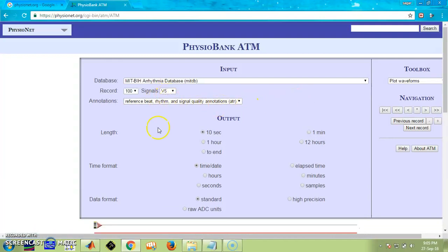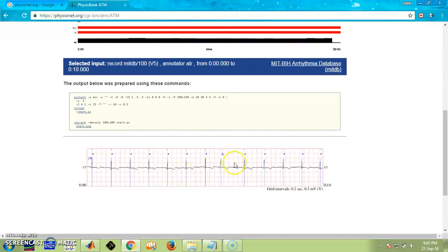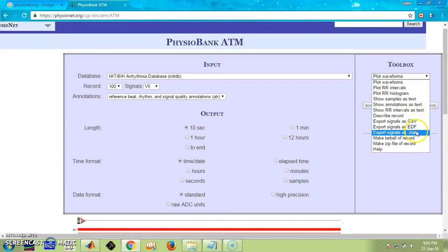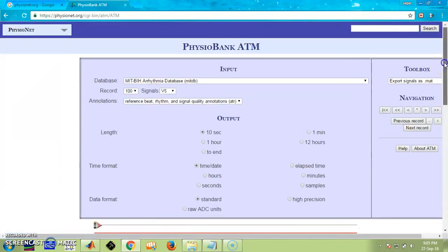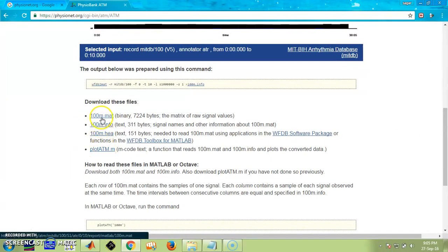Select V5, and here you can choose the length of the database. I am selecting the 10-second default database length. The plot waveform option is already selected, so you can see the waveform available for the database. But we are not interested in this waveform here — we need to plot this waveform in MATLAB. Click here, and there is the option to export the signal as a .mat file. Click on it, and as you drop down, the different files are available, including the .mat file which can be opened in MATLAB.